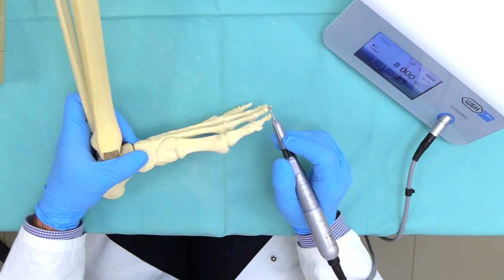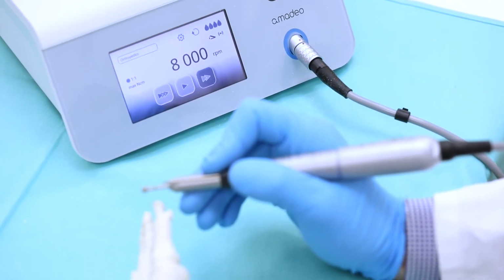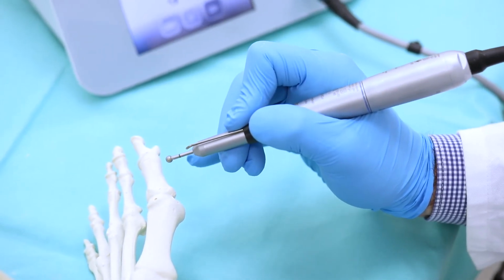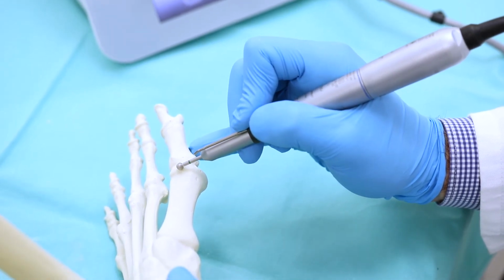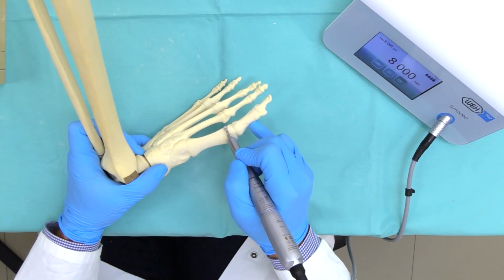When milling the bone, we use 8,000 rounds per minute or up to 40,000 rounds per minute. If you have a mild exostosis, you can use 8,000 rounds per minute.